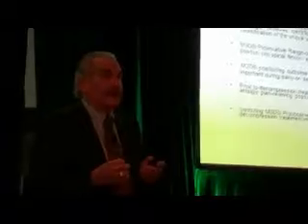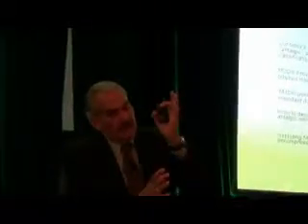I had a physical therapist who came in to observe me about a year ago on a patient with severe leg pain. And I immediately put the patient in protocol 1 flexion without moving the leg piece right or left. And she said, wait a minute, didn't you notice the patient has an antalgia, an involuntary muscle spasm? I said, you know what, you're right. It's a shift, we call it a shift.